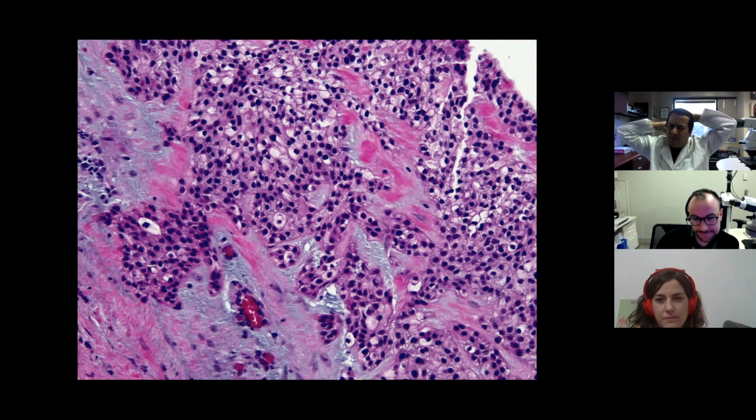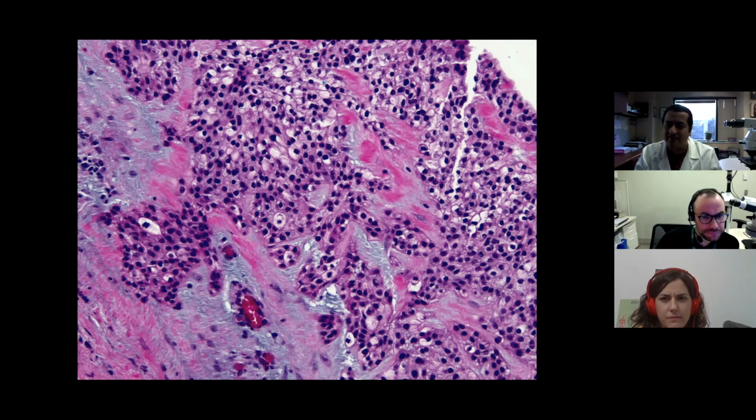So this patient has a very small central lung nodule, like maybe 9 millimeter, close to a bronchus, that was incidentally discovered. It was found to be negative for TTF1 and positive for P63. Interestingly, the patient underwent a sequencing panel and was found to have an EWSR gene rearrangement. So an EWSR gene rearrangement, P63 positive, and a very small central lung lesion. There's no history of malignancy anywhere.